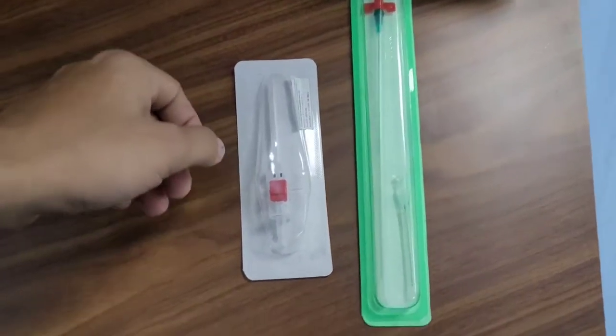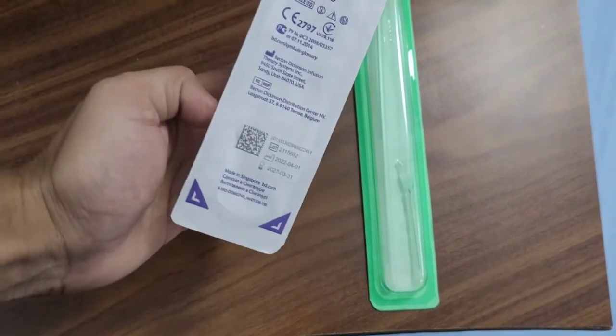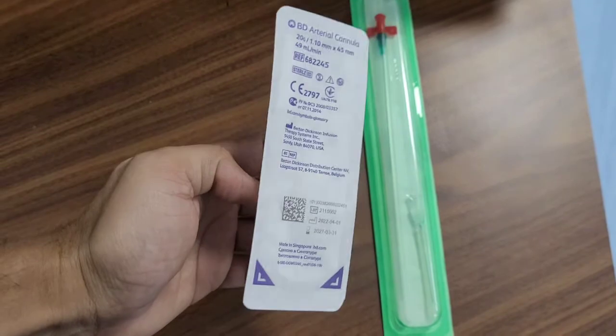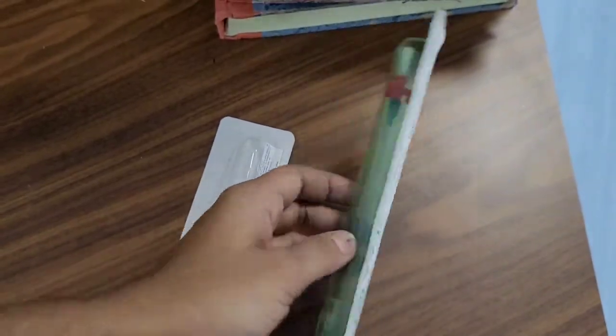These are the arterial cannulas for invasive blood pressure monitoring. This is a BD cannula, 20 gauge, and this is a Leadercath, 22 gauge.